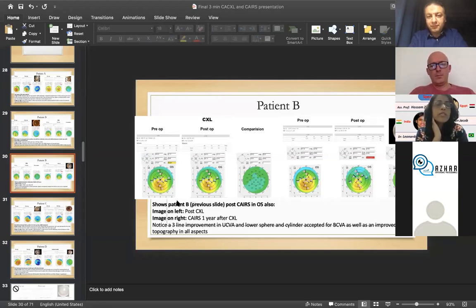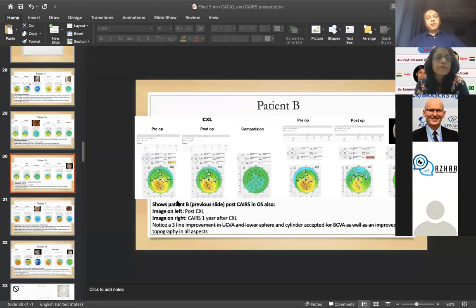The nomograms, yes, we are getting them in a very good place because we're getting very good results. Even previously, one thing that I find about ICRS is that the very fact that you can do this always gives you regularization. Now it's just fine tuning that matters, and we're able to get that fine tuning now with the nomograms. Okay. Thank you.